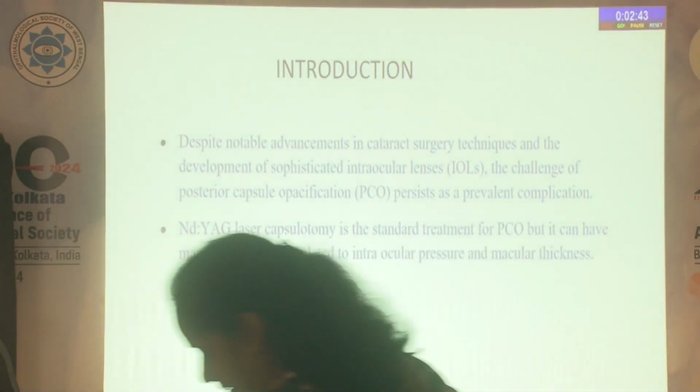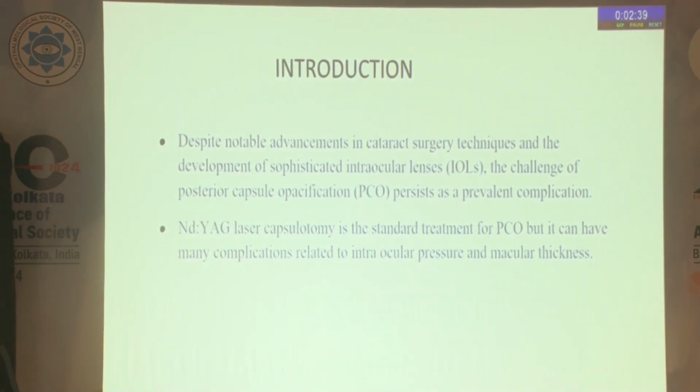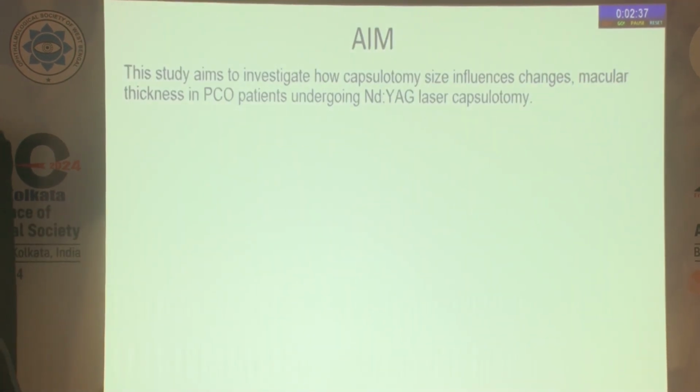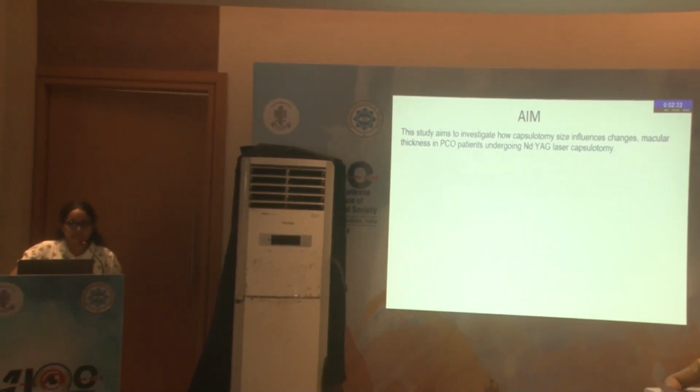YAG capsulotomy is the standard treatment for PCO, but it has many complications related to the intraocular pressure and also macular thickness. The aim of this study is to investigate how the capsulotomy size influences the changes in the macular thickness.